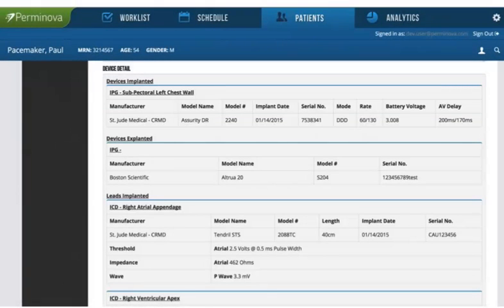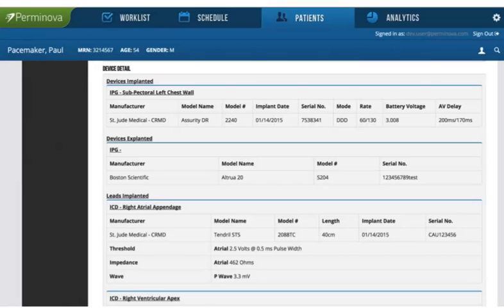Once you sign your operative report, it is sent to your hospital's EMR, to the referring physician, and finally to your hospital and professional billers.